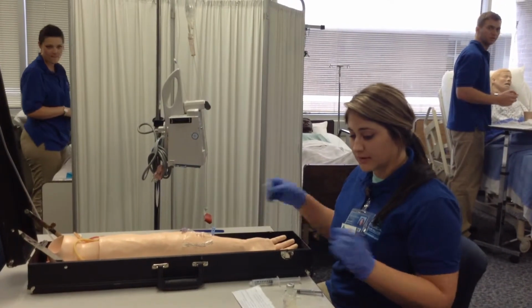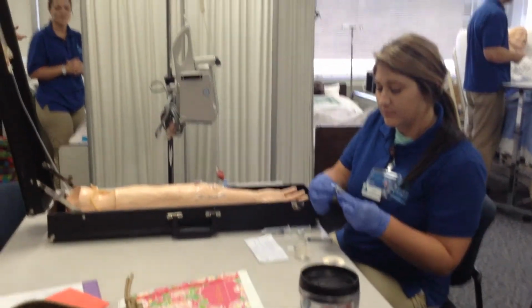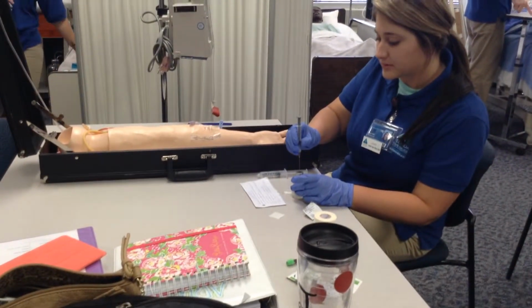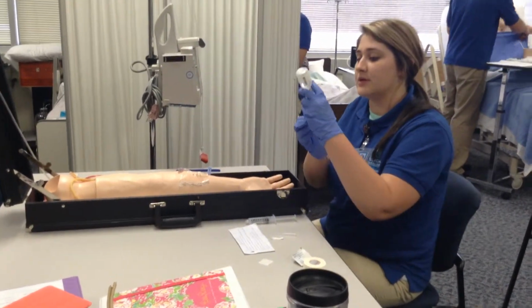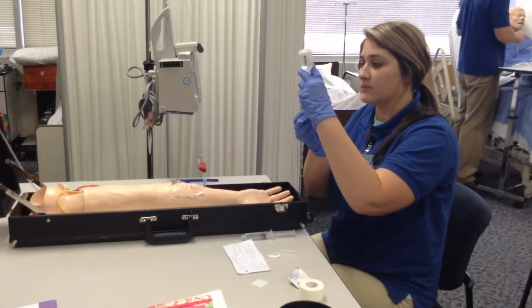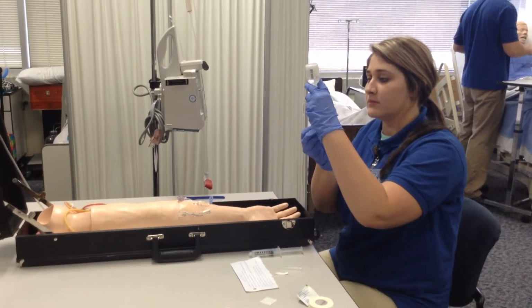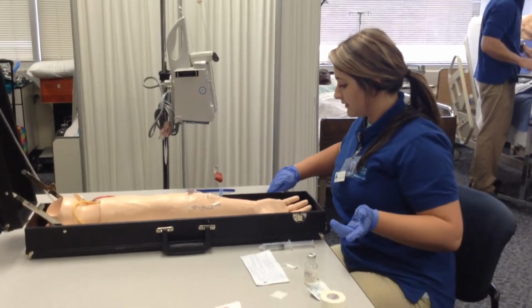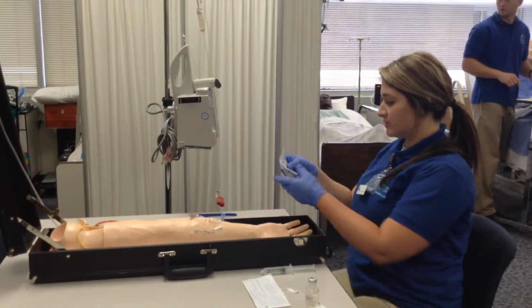And I'm going to clean my medication off with alcohol, let it dry, and I'm going to insert my air, and I'm going to invert my medication. And I've already applied my label to my mini bag.